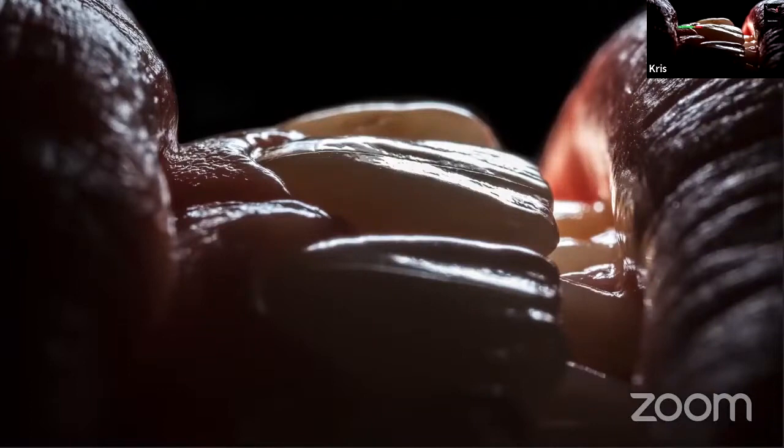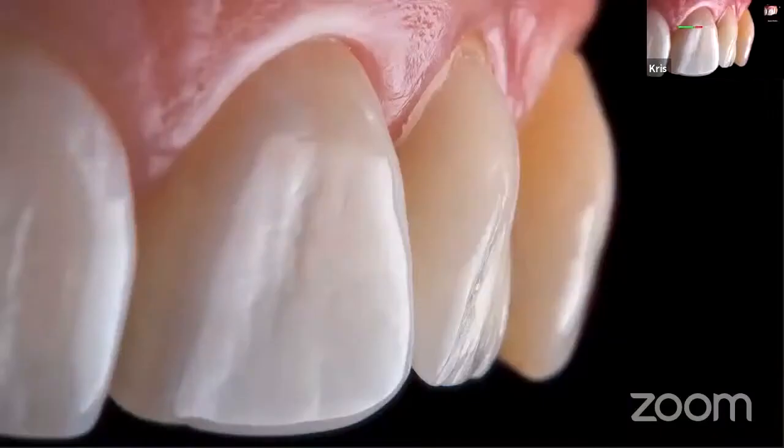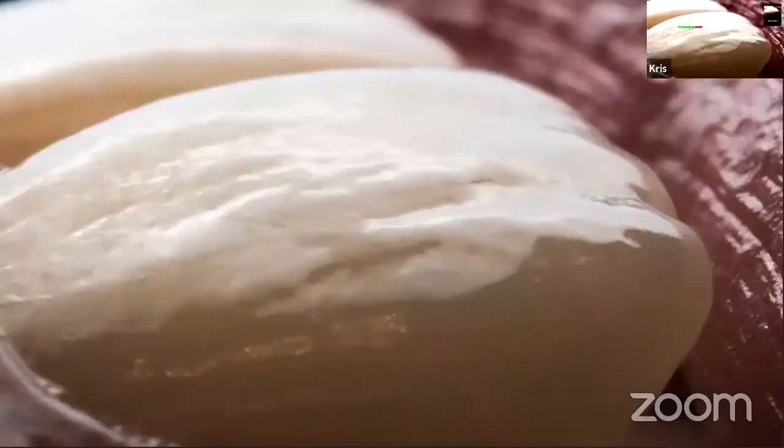And especially when you sometimes see patients with beautiful teeth, you just add a few more minutes in your appointment just to take these kinds of shots, where patients are also involved and happy. So depending on the quality and the volume of the light, you can register amazing things on the surface of the teeth. And this type of texture helps a lot in the communication with dental technicians, how to really go with these pictures.